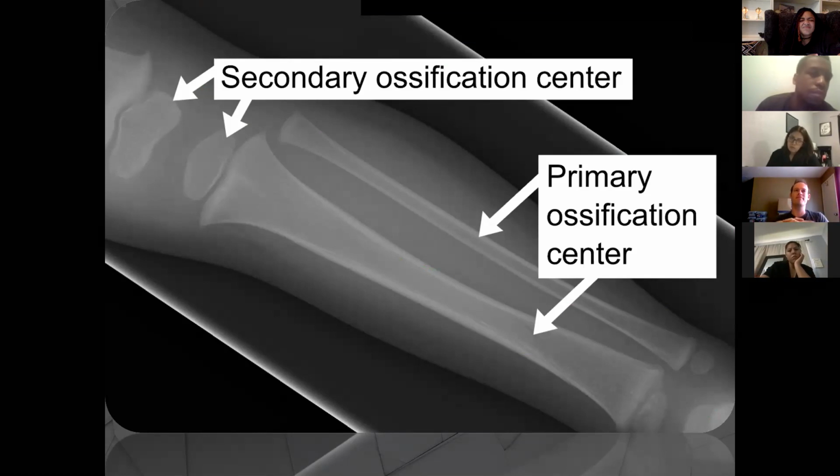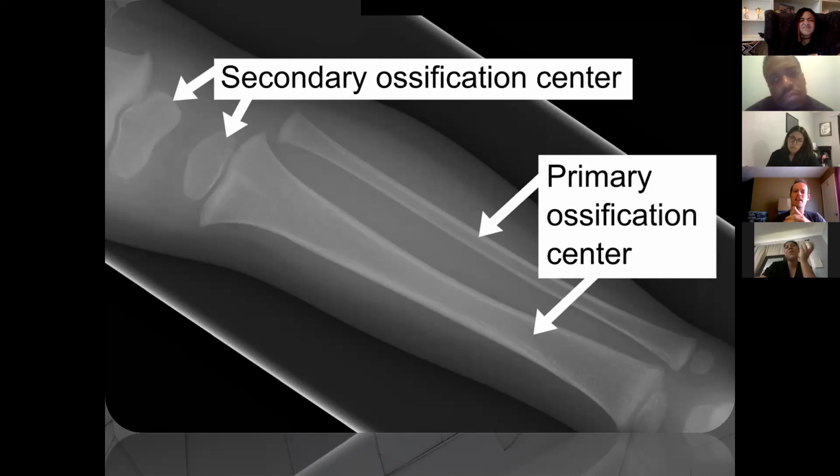Look closely. Wouldn't the radius and the ulna be more close together, or maybe I'm just not looking at it right? Well, first off, rethink what we're looking at, because it isn't a radius or ulna. Is it the foot? I can't see, I'm on my phone because it kicked me out. This is a tibia and fibula. Oh, okay. There's a big gap between the femur and the tibia and fibula.